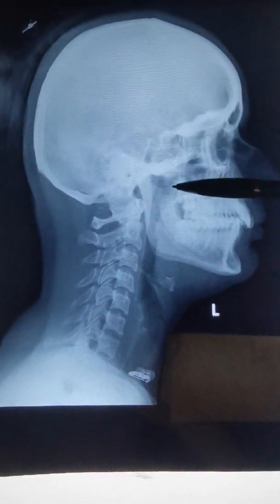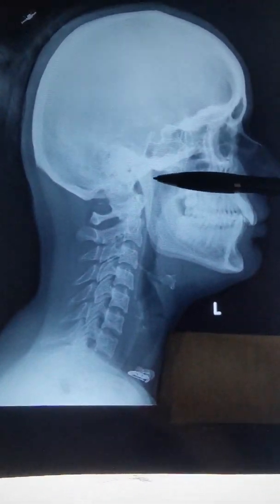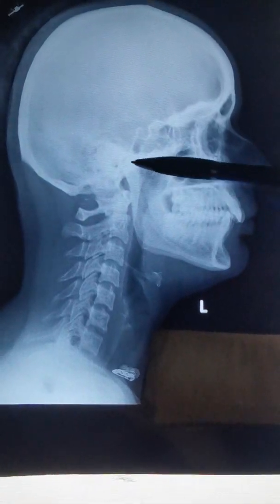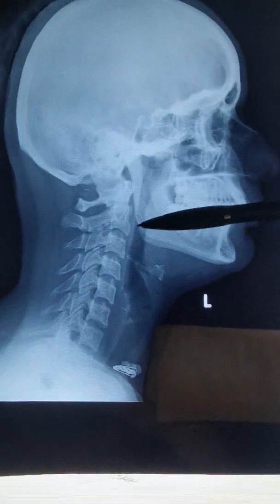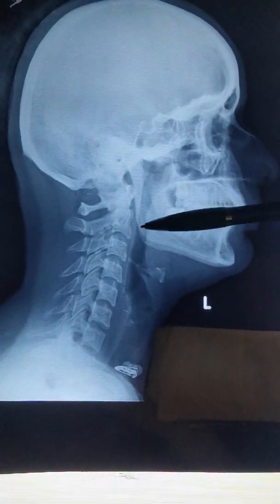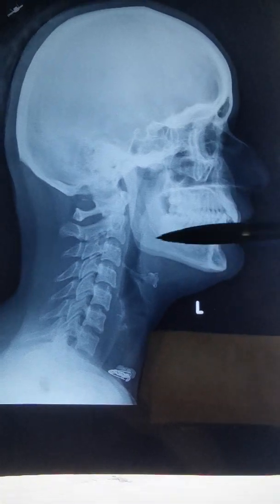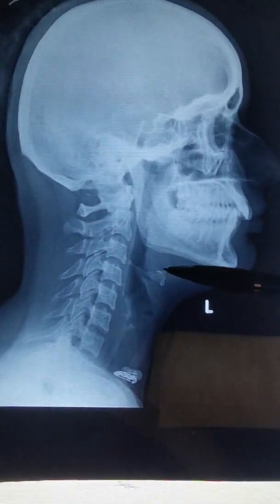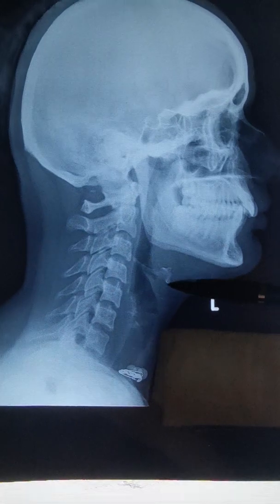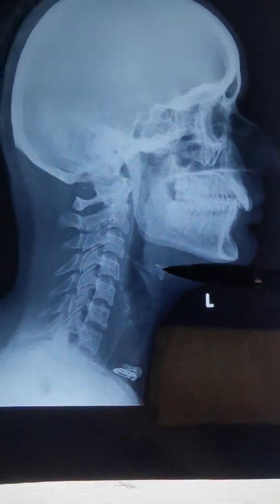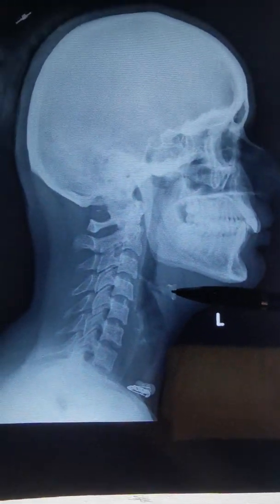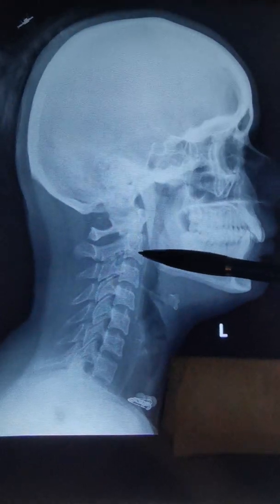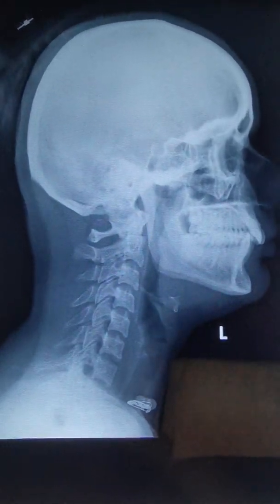This is the coronoid process, this is the coronoid notch, and this is the condyle. Here is the ramus and the body of the mandible. Below there is a tiny little bone called the hyoid bone. And as discussed earlier, these are the vertebras.